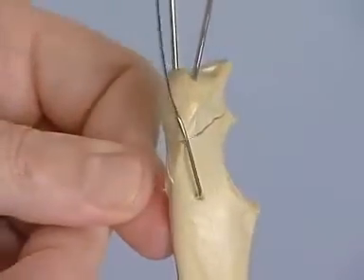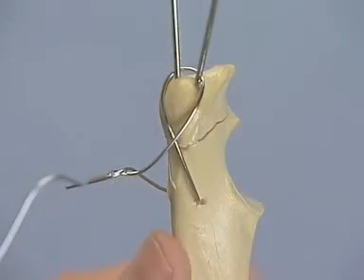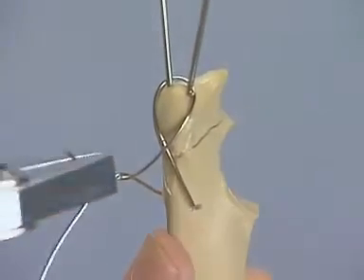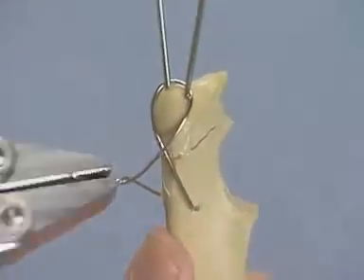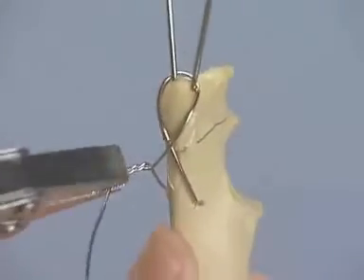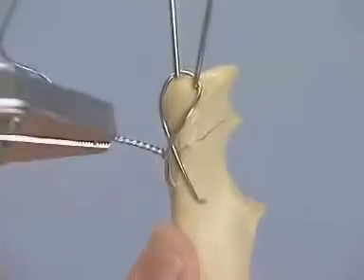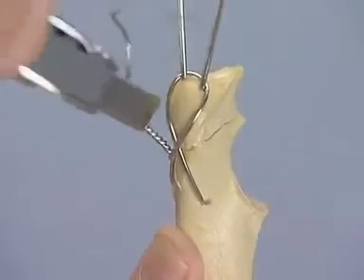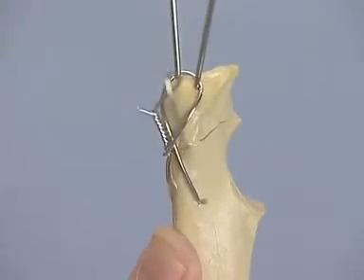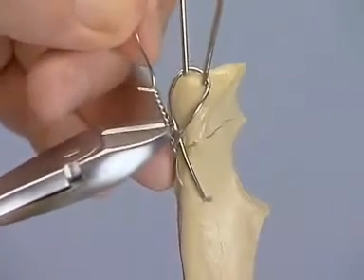The wire is brought tightly around the K-wires at the point of the olecranon, and while applying even tension to the free ends, twist them together, forming a figure 8. Continue to apply tension while twisting until the wire is tight. Now release the tension on the wire and continue to twist. The wire twist will come to lie flush with the straight portion of the wire. Cut the excess wire off at the level of the fourth twist.